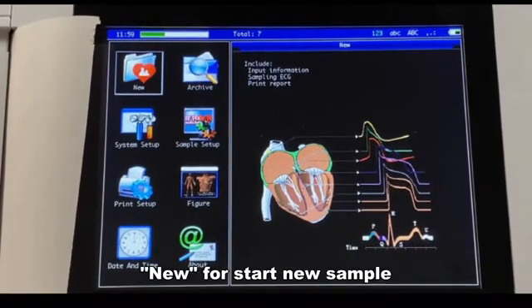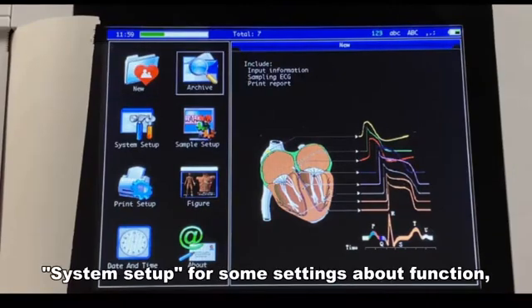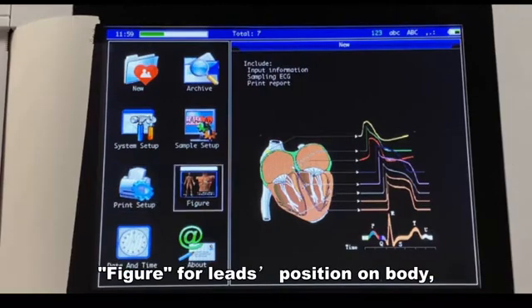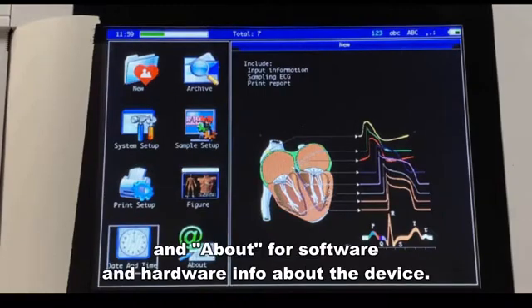There are some buttons: New for starting a new sample, Archive for reviewing data, System Setup for settings about functions, Sample Setup for settings about sampling, Print Setup for settings about printing, Figure for leads' position on the body, Date and Time for the device clock, and About for software and hardware info about the device.